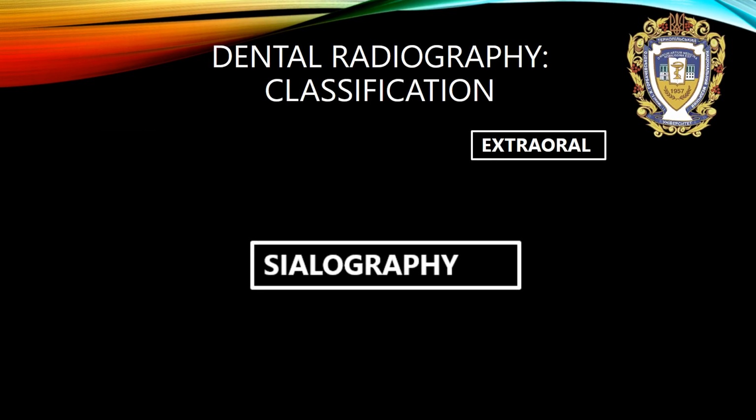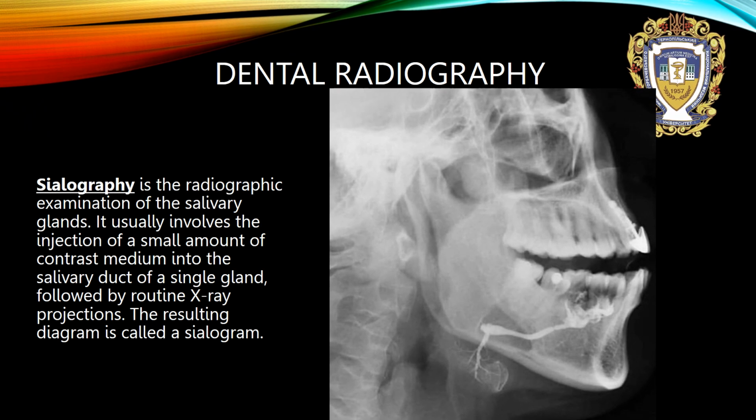And sialography. What is it? Sialography is the radiographic examination of the salivary glands. It usually involves the injection of a small amount of contrast medium into the salivary duct of a single gland, followed by routine X-ray projections. The resulting diagram is called a sialogram.